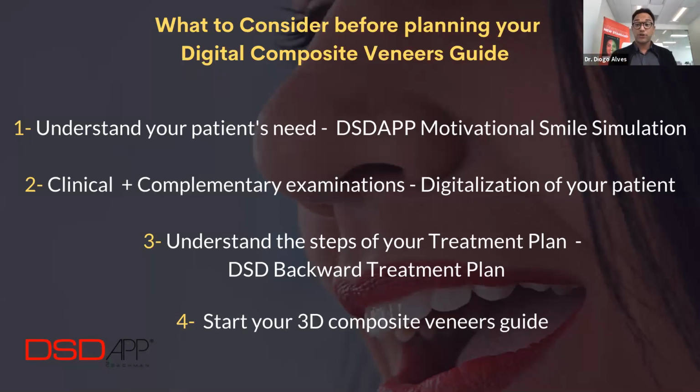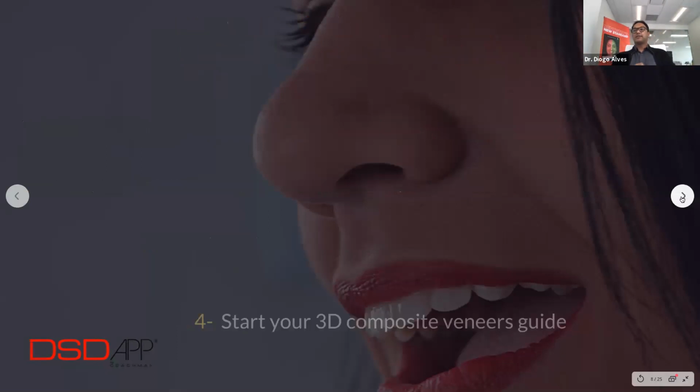So if you guys are watching on your computer, I would take a screenshot, take a picture. If you're watching on your iPad or iPhone, just take a picture of that, because that will be the base of our webinar today. And this is even if you are doing it on your own. If you understand those 4 pillars, you will understand how you can become a digital dentist. Really great information. All right, so let's start with understand your patient's need.